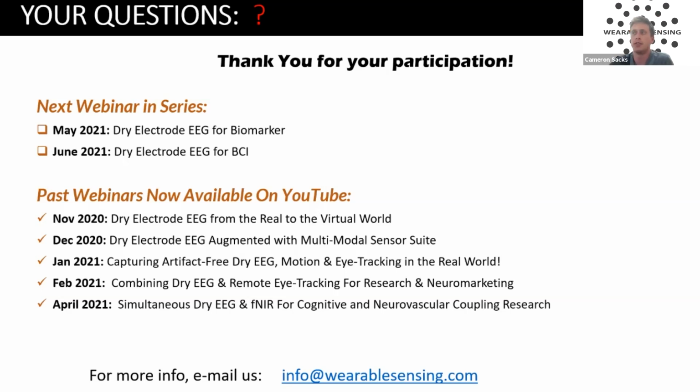Next question, have you observed any systematic differences between dry and wet electrode measurements? Great question. So we showed the figures that I showed earlier. We're getting 90% plus correlations between simultaneously recorded wet and dry electrodes. Of course, those are juxtaposed, side by side as opposed to co-localized like the fNIR and EEG. So that probably explains the differences.